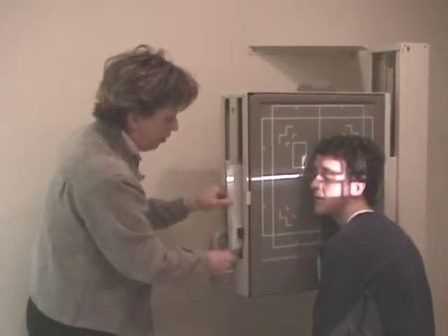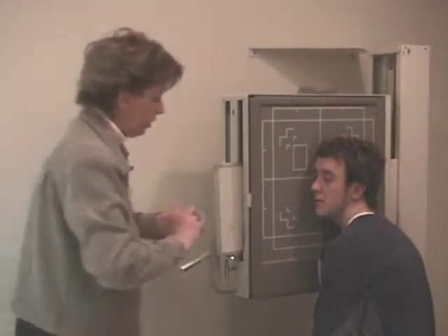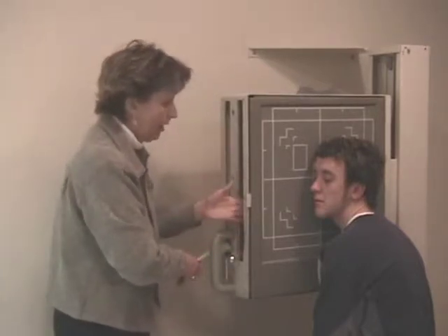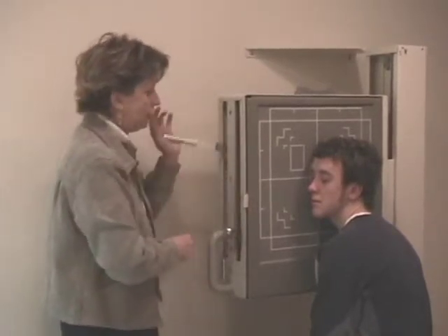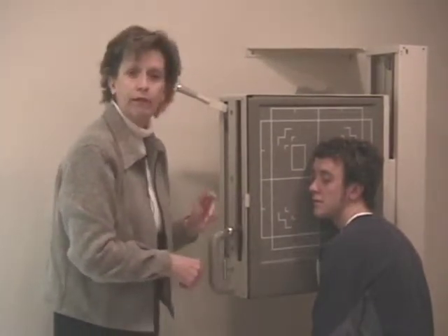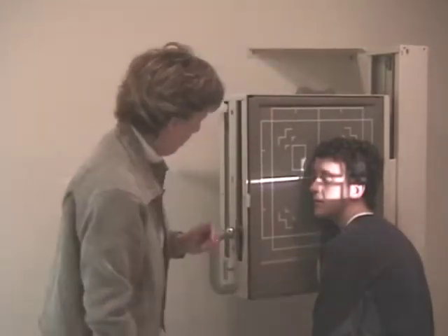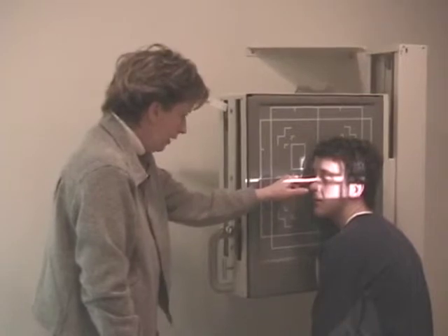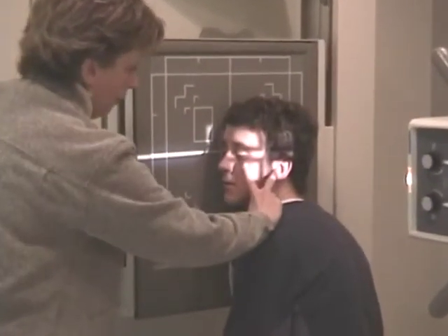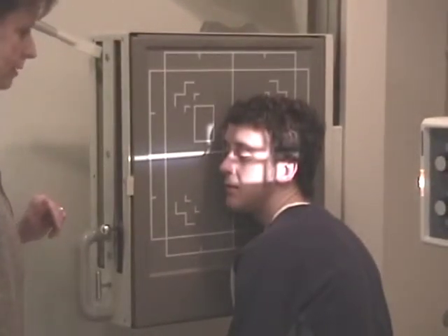You changed your film. This is a right lateral for the purpose of this demonstration, so you could see the patient's skull from the camera angle. If the patient is having pain on the left or pressure on the left, then you would do a left lateral. Okay, and you make sure the tube, I did line that back up. So again, the interpupillary line perpendicular, MSP parallel, infraorbital meatal line parallel, demonstrating all four sinuses.